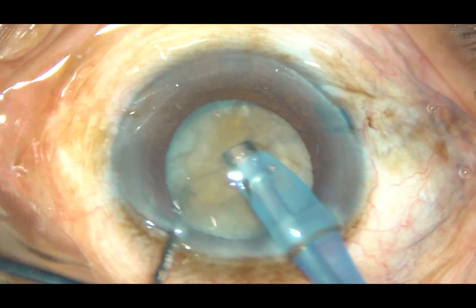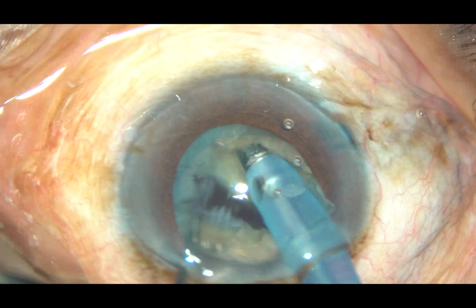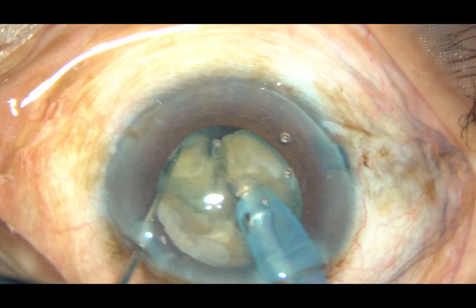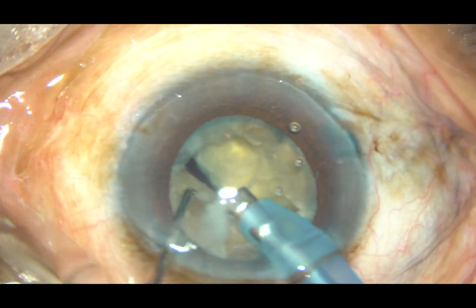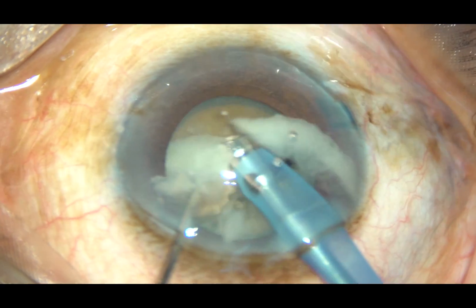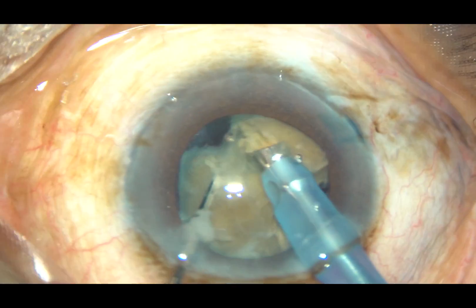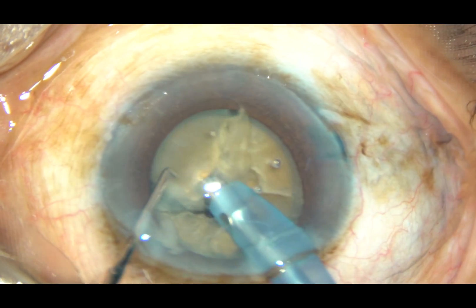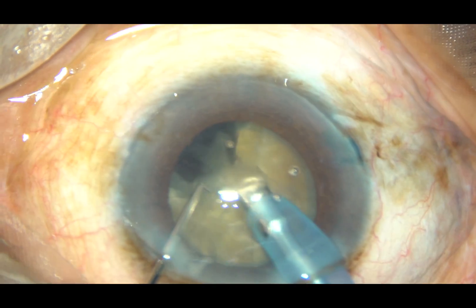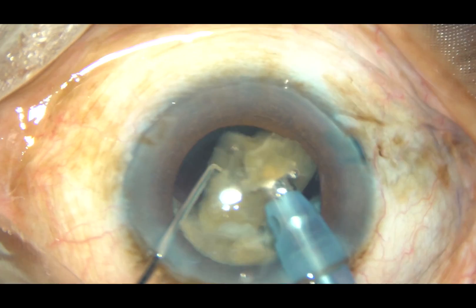Rotate the nucleus 180 degrees. Sculpt on short strokes, go to a deeper plane, and then hold the hemi-nucleus on the right side and separate the nucleus into two halves. Again, subdivide each hemi-nucleus into two parts. You can see here a big chunk of homogeneous epinucleus — curd-like. This is the sign of hypermature sclerotic cataract. In morgagnian cataract, it becomes milky fluid. In sclerotic cataract, there is no fluid; the epinucleus just becomes a white homogeneous sheet without any fibers.